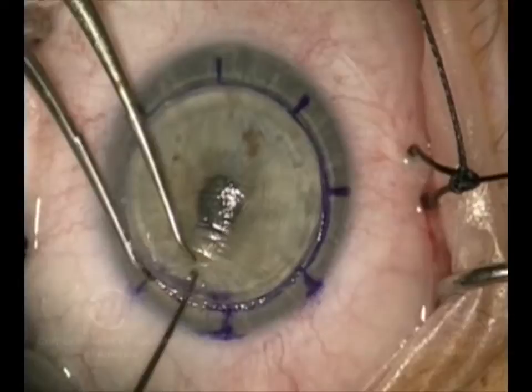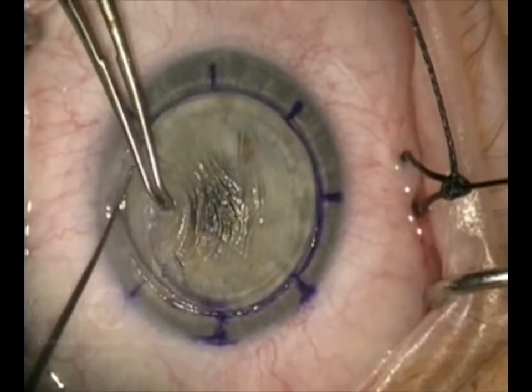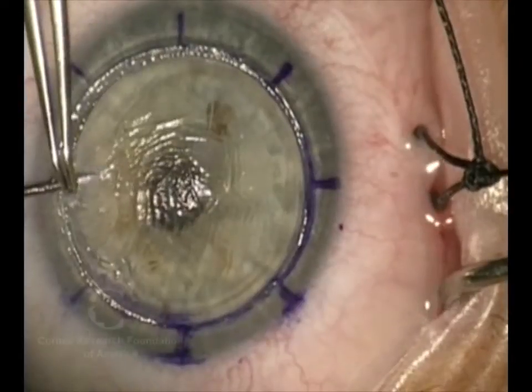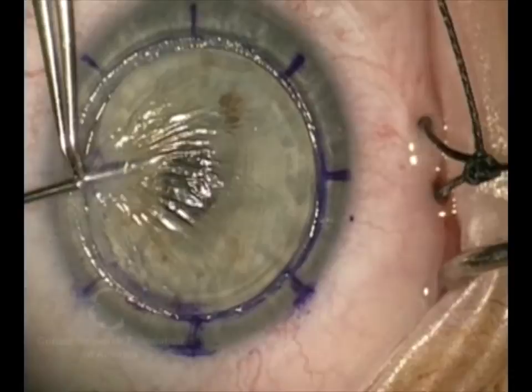This cornea has already been cut with a femtosecond laser that gave us a zigzag incision. That is essentially a tongue-and-groove like we have in carpentry, so that the edges of the donor and recipient stick together more completely and more firmly and strongly.